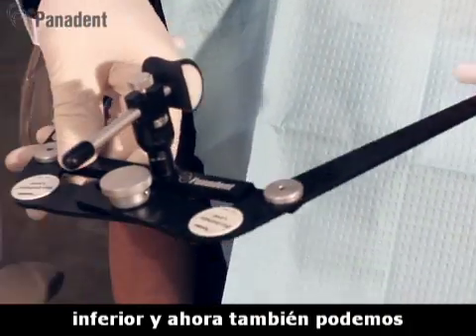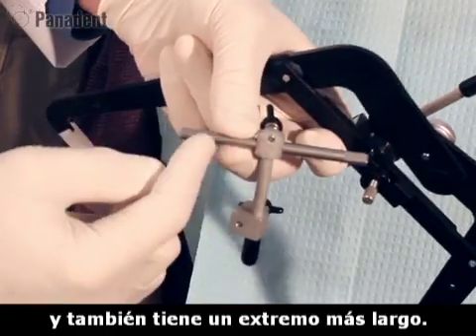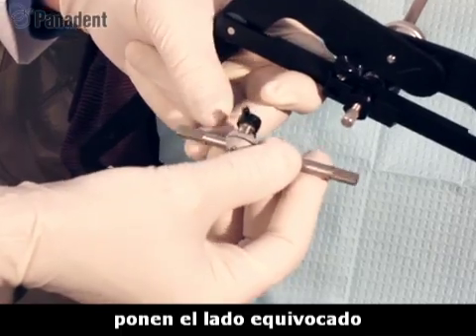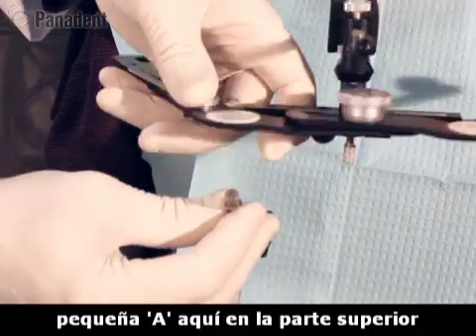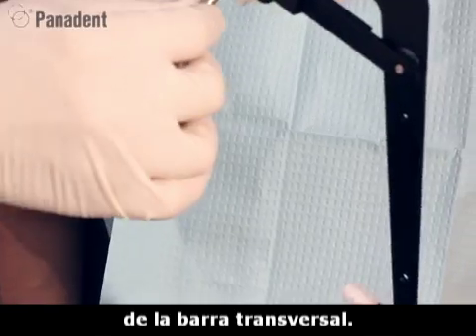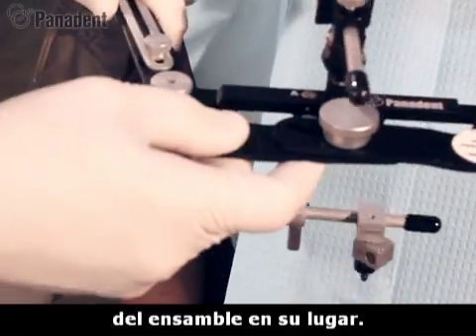Now we can also attach our bifurk assembly. The bifurk assembly has a shorter end and a longer end. We like the shorter end to go into the crossbar, but some people inadvertently put the wrong end in. So we designate a little 'A' on the top of the pin that also coordinates with the little 'A' on the top of the crossbar. We line A with A, make sure the flat is towards the screw, and then tighten that screw, locking the stem assembly in place.